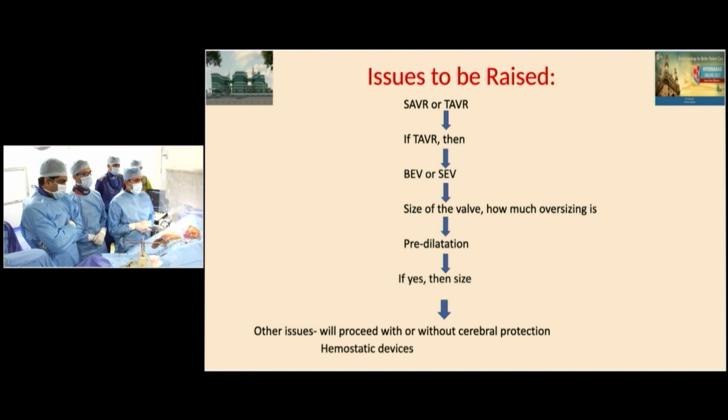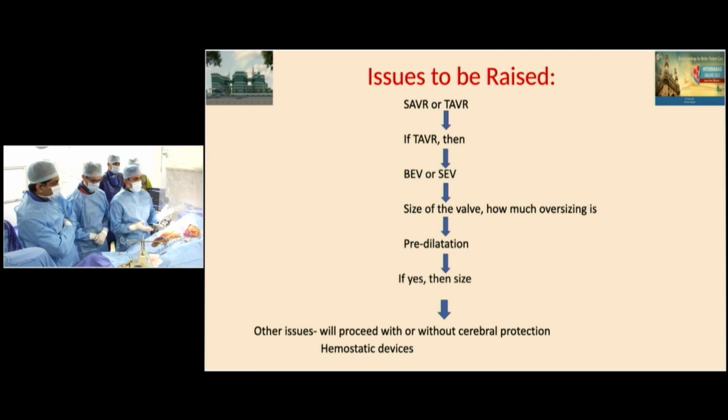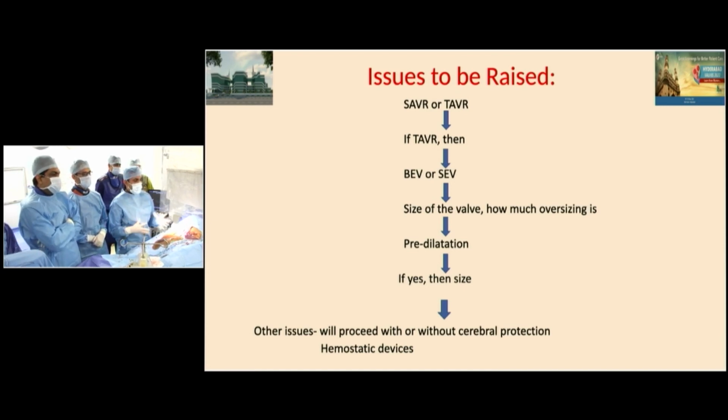We are not using any cerebral protection. Clearly now the data does not support a routine use of cerebral protection. We were using it in the initial phase, but now we have reserved it only for valve-in-valve or a BASILICA procedure or a heavily calcified arch or a patient who had a prior stroke. So no routine use of cerebral protection device for sure.